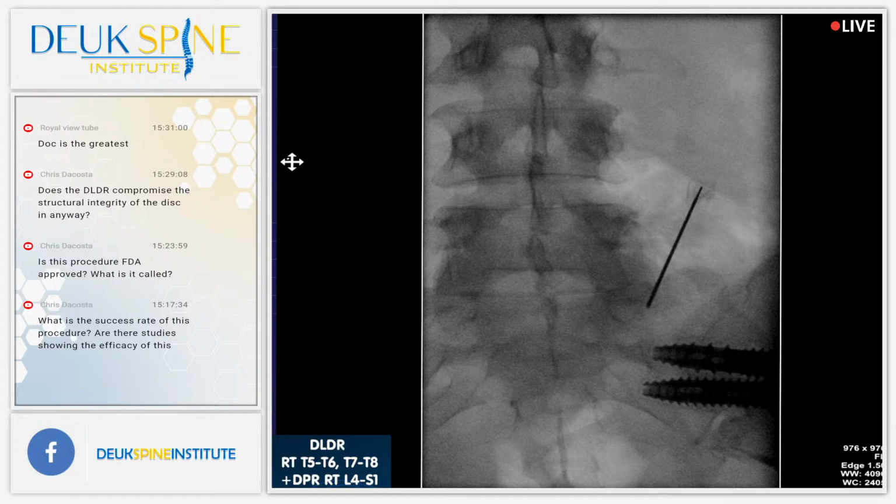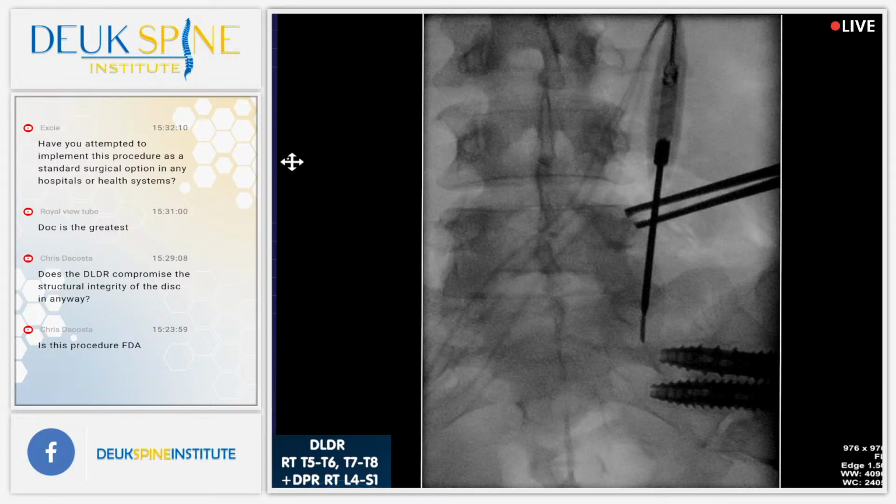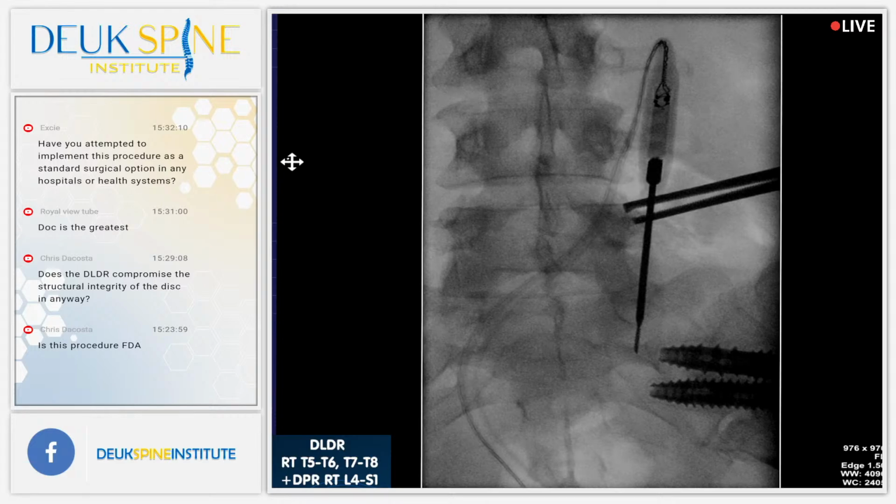But so far, everything that we're doing is happening well for her. Just need to get down to the sacrum for this last week. It's really a burn, by the way. Too low. We're actually burning the pain nerves. Shot. Too low. Shot.